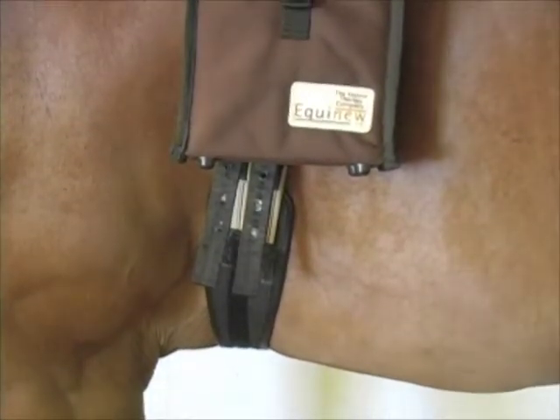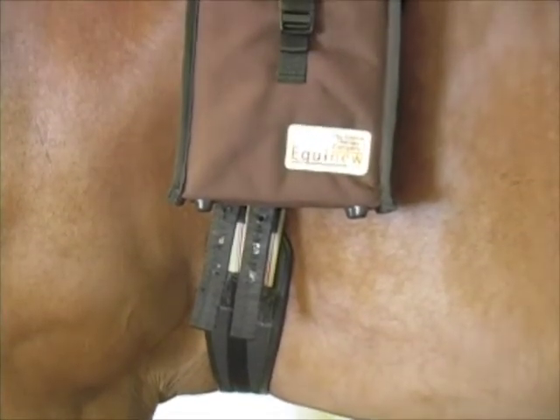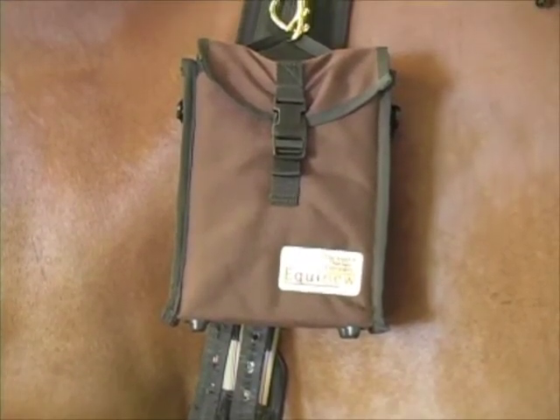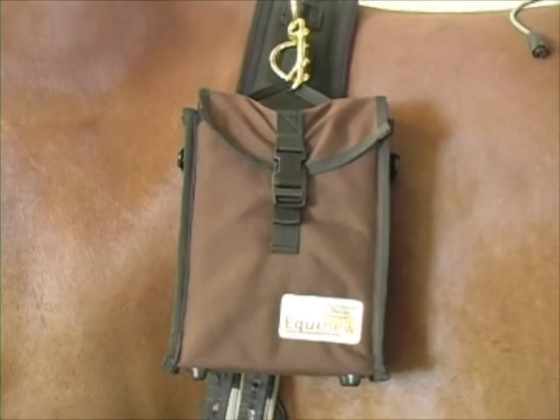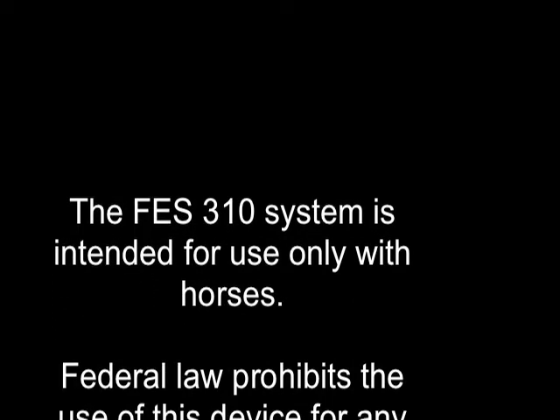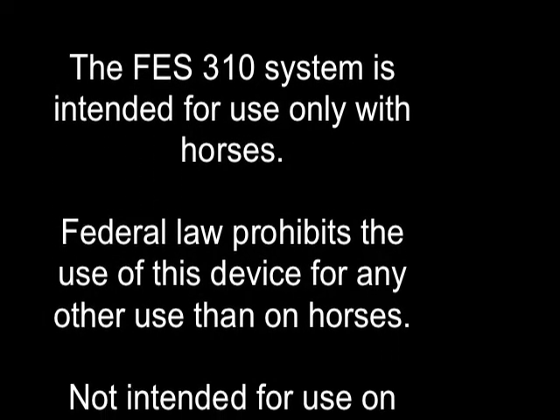The suggestions contained in this instructional DVD are based on general conditions and may or may not be directly applicable to your situation. Almost all horses accept the sensation of the stimulus in a relaxed manner. However, care must be taken that each horse is introduced to the stimulus slowly and carefully to avoid startling the horse when the contractions begin.